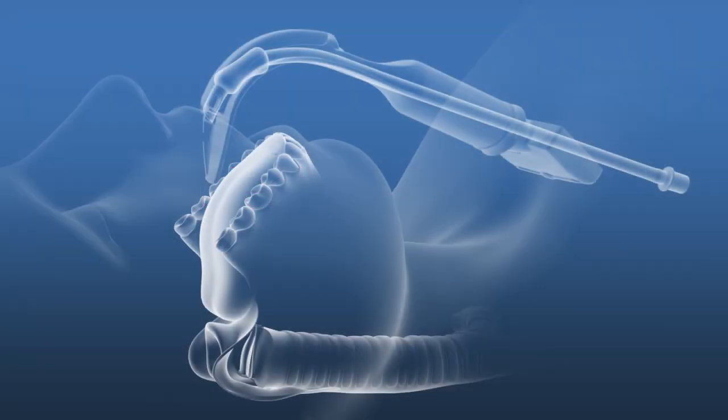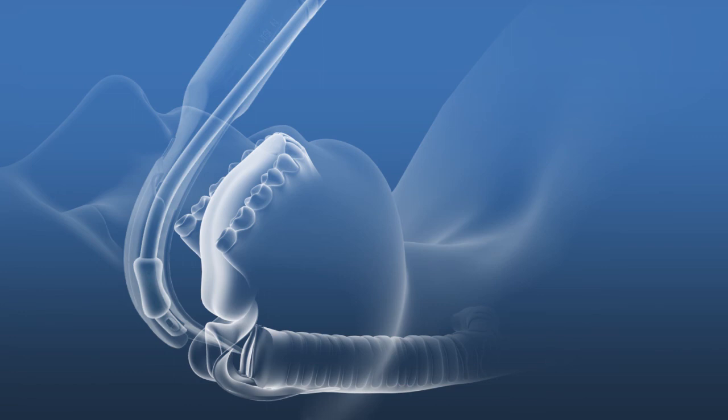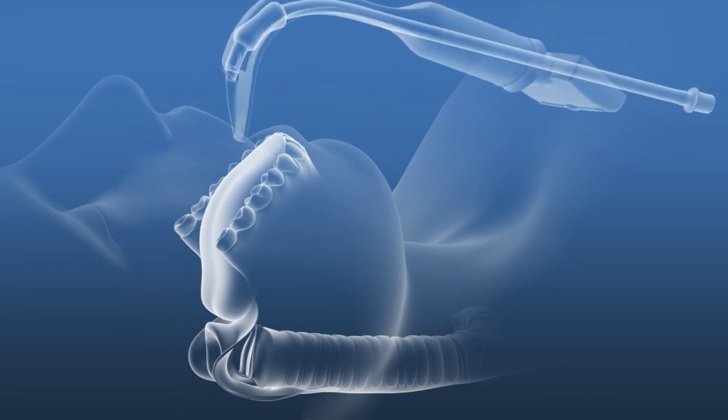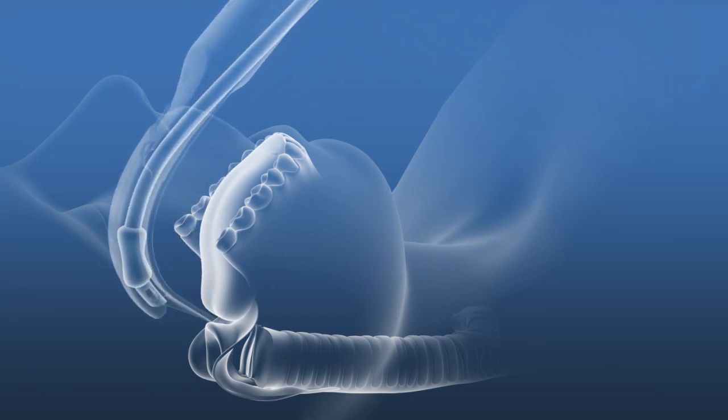The most common issue associated with ET tube placement with any video laryngoscope is that the blade tip is advanced too far. This may provide a good close-up image of the vocal cords, but the tube cannot advance further due to the blade obstructing its passage. To address this issue, follow the anterior surface of the tongue and place the blade tip in the vallecula. If too close to the vocal cords, withdraw the blade slightly to obtain a more panoramic view. Gently lift in an anterior direction prior to attempting to advance the ET tube.